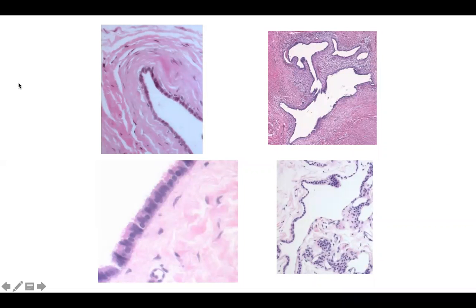Welcome back to DD60. Today we'll contrast four entities with a large white space that is lined by cells. It is most important to look at the cell shape and any unique characteristics. The stroma might also be helpful. Can you guess the diagnosis for these four?